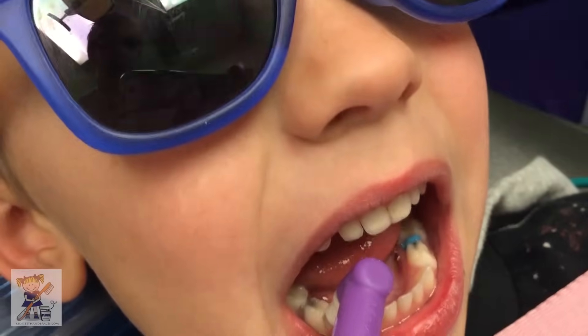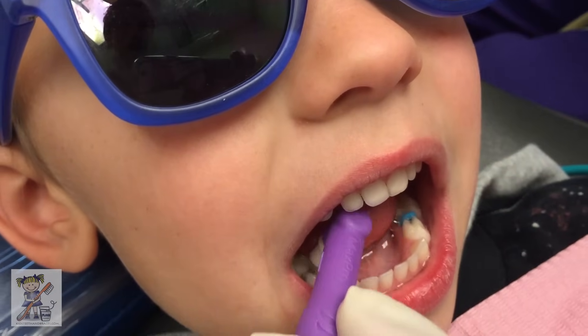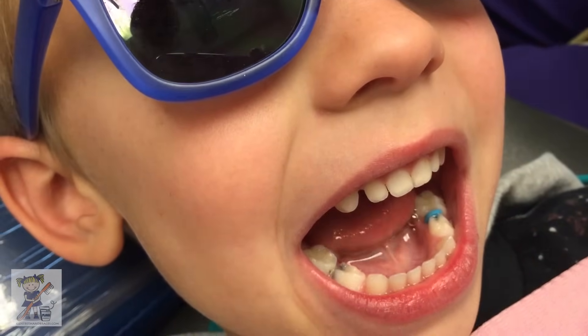Is this easy? Do you like getting superhero crowns on your teeth? Okay, we're going to rinse it.